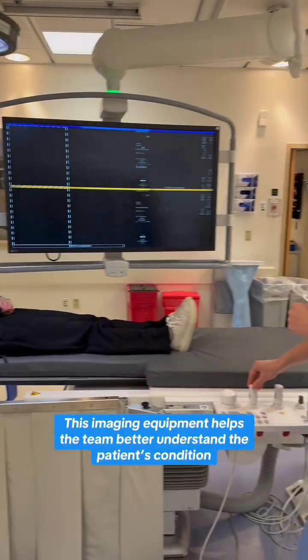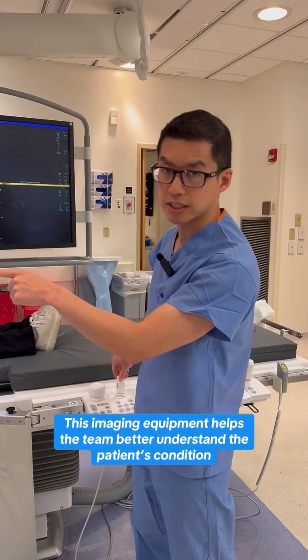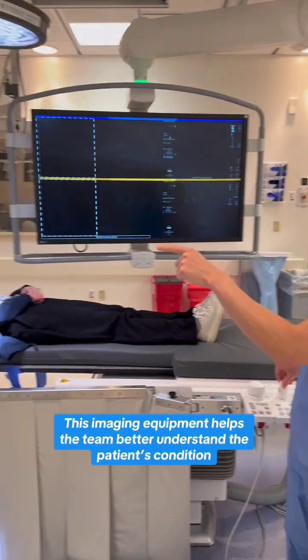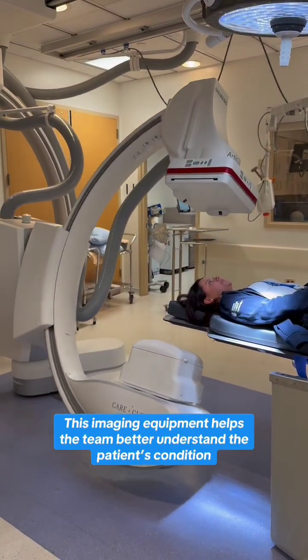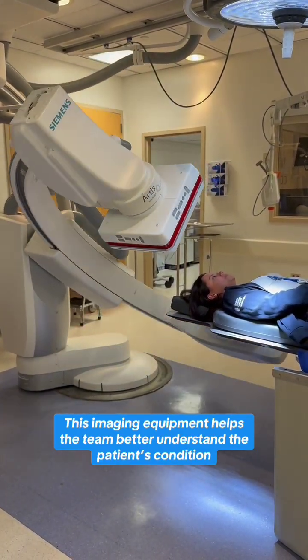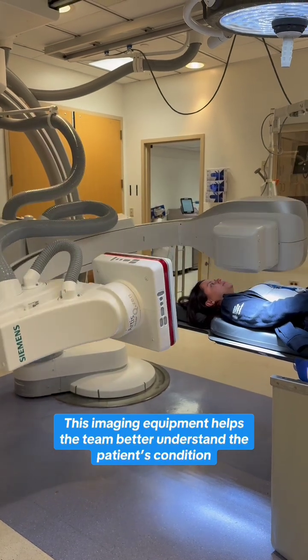Oftentimes, we also use pictures that are rotating, so we'll inject the contrast dye as this machine turns around, and that way we can do a reconstruction in three dimensions and tell us the views that are ideal for the subsequent procedures that we're going to be doing.